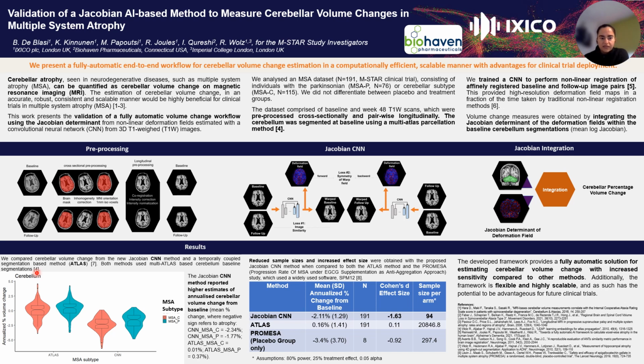Both methods use the same baseline cerebellum mask. As you can see, in red it shows the MSAC subtype, in blue the MSAP. The CNN method is able to measure sensitively the volume change in the cerebellum.